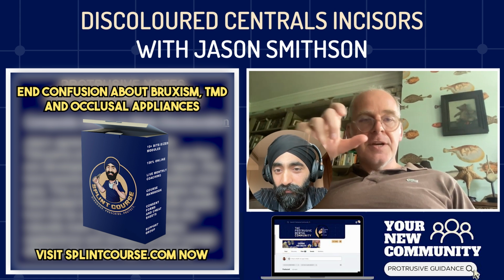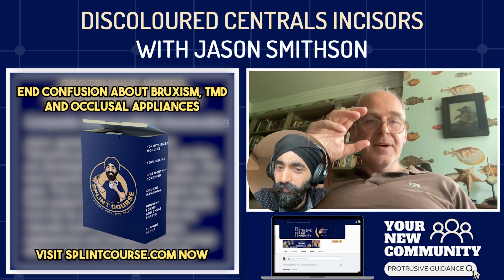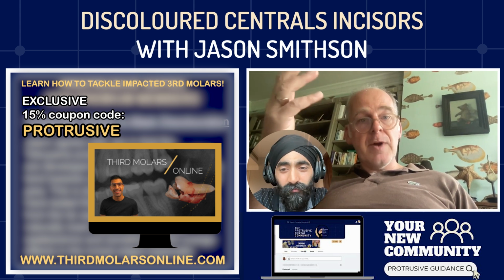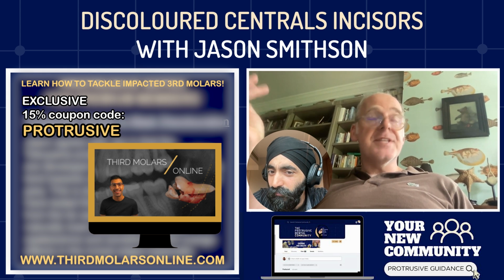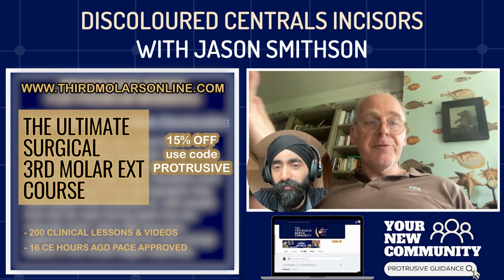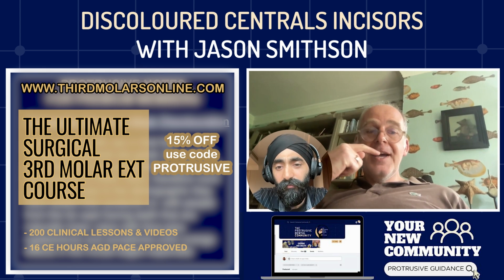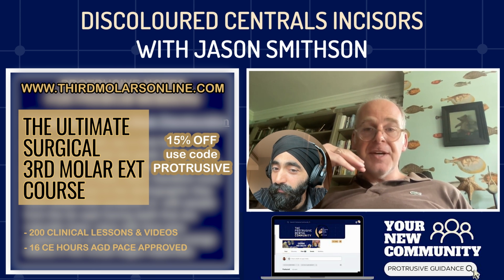The only downside with the Tokuyama product is it's designed in Japan, and I think I was the first person to notice this, and I think I've been saying it for quite a while, but it tends toward the low value, it tends toward the grayer. And the reason for that is the demographic they've tested that resin on. People from the Far East tend to have lower value teeth. People from the Far East tend to have more triangular teeth, slightly lower value, and something I really like, which is really cool, is a really strong blue-grey opalescence and sometimes even orange effects in the incisal ledge.